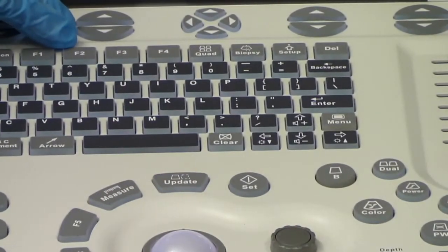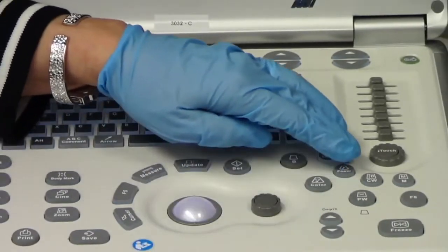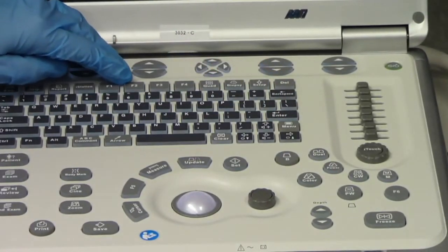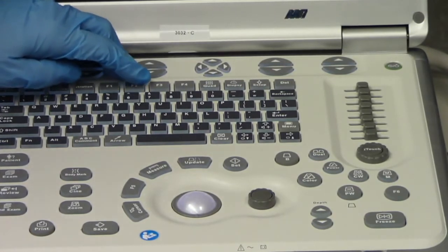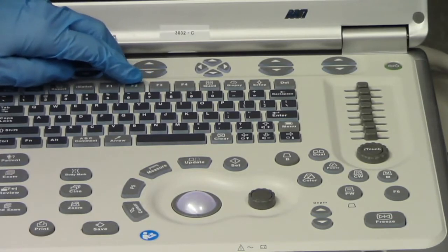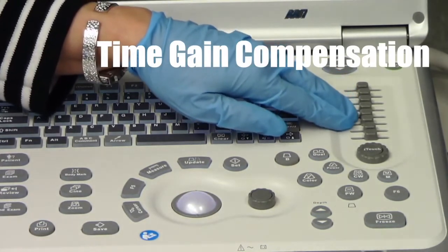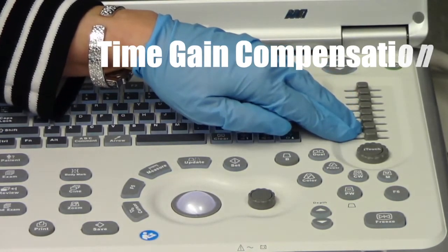Now, before you begin your exam, you'll want to just leave these in their default position, because all of these will be preset to what the abdomen depth should be anyway, but you'll have to make adjustments to that once you start. Now remember that we have the time gain compensation. You want to just keep those central on their slides before you begin to scan.